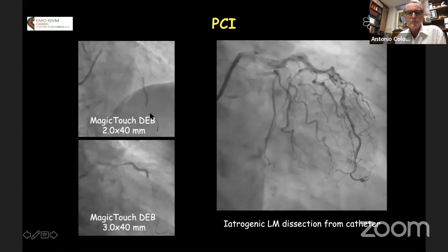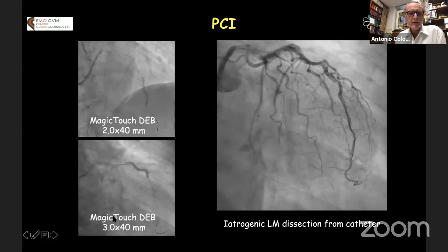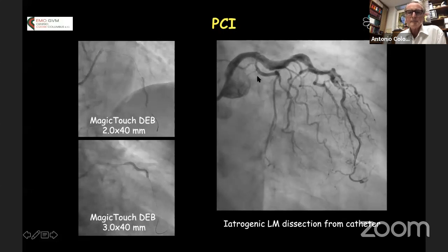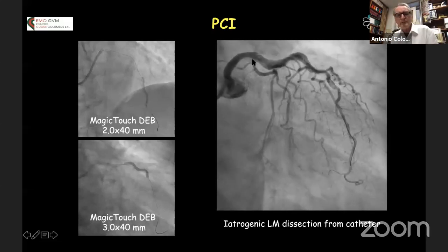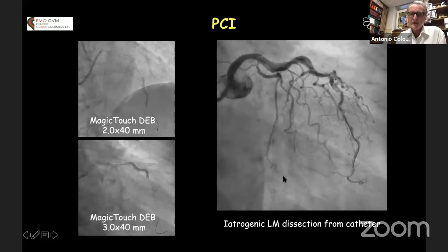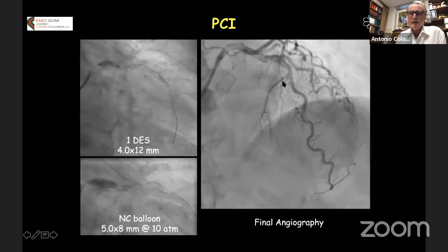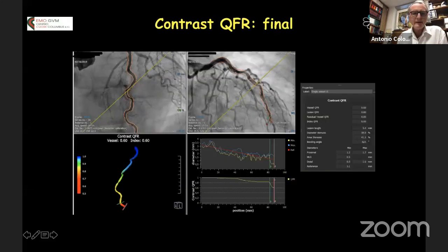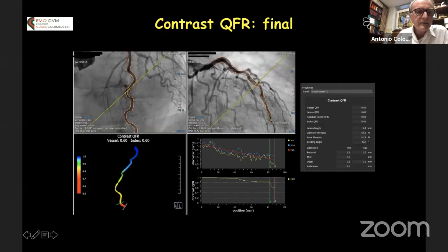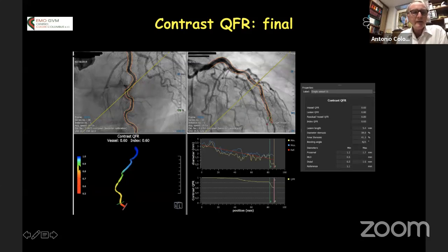Based on IVUS evaluation, we did drug-eluting balloon distally 2.0×40 mm, more proximally 3.0×40 mm. Unfortunately, with the guiding catheter we dissected the left main, so we had to place a short 4 mm stent in the left main to treat an iatrogenic dissection — this was inconsequential. All the rest was treated without stenting, not even as a bifurcation. We repeated the QFR: positive only in red very distally; yellow is 0.80; bluish is close to 0.9; and proximally including the bifurcation of the diagonal is above 0.9.